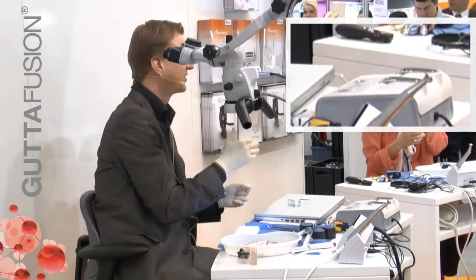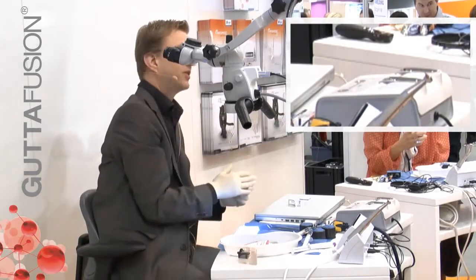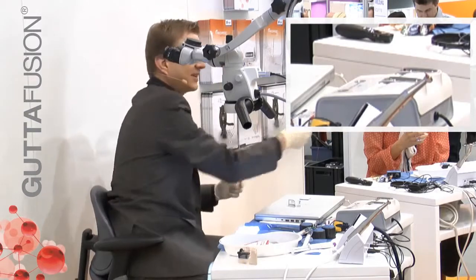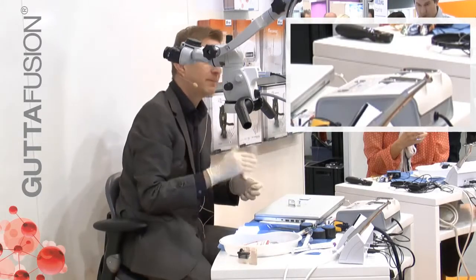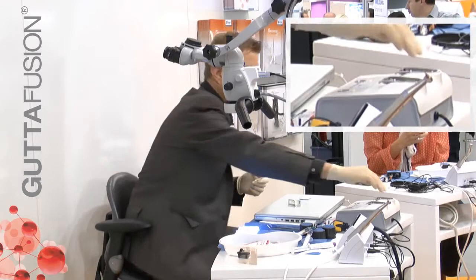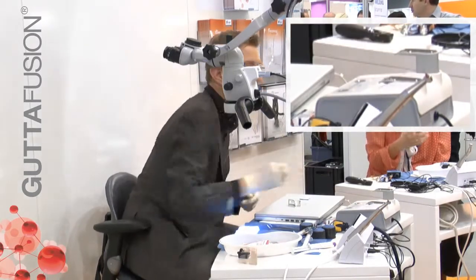You know, with the students, they were always very anxious that it would cool down on them too quickly, so they inserted it and went like this. It's like stabbing. But you know, it's a warm material, it needs to flow somewhere. So that's why it's important to insert it really slowly. And if we do so, then we allow the material to actually adapt the way that we want it.